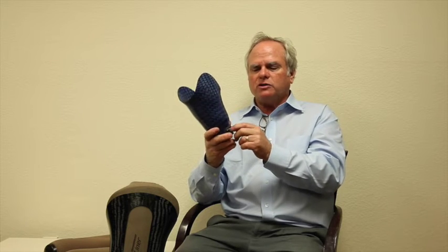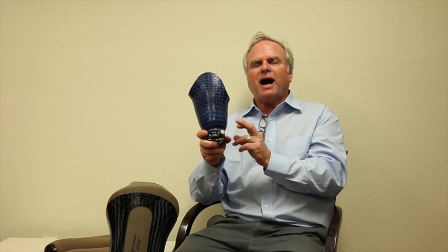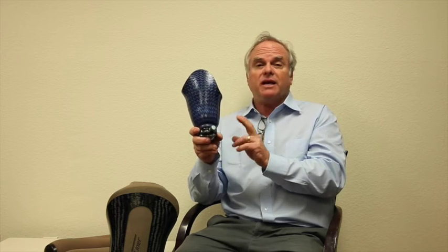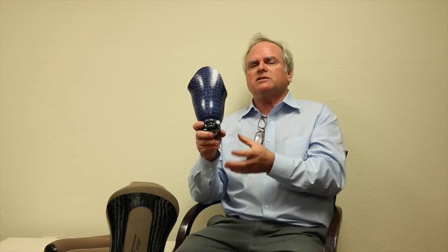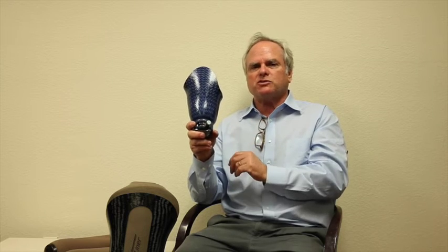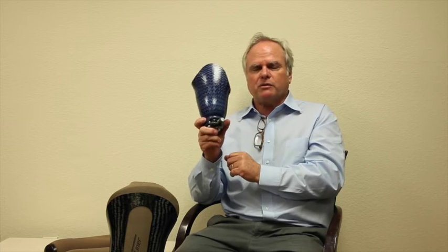If you are using a carbon or a fiberglass, both of them are coated with an epoxy coating. It's called sizing, but that's epoxy. The reason why is nothing sticks to glass and nothing sticks to carbon. So they have to completely encapsulate it in order to give it something to hold on to. But in essence, that weakens the bond between resin and fiber. NSP does not have any sizing, and the bond between the resin and the fiber is much stronger, and that's why I'm totally recommending you use that when you're using a Maglock.